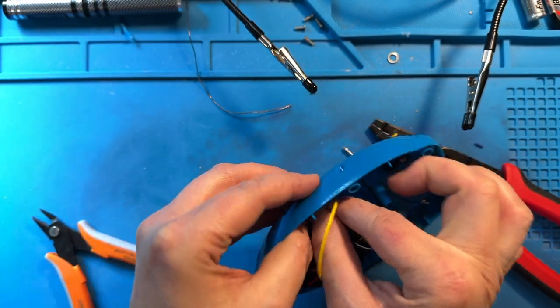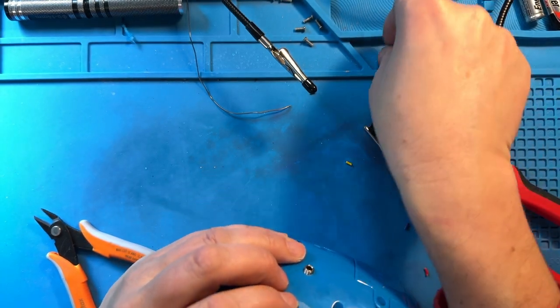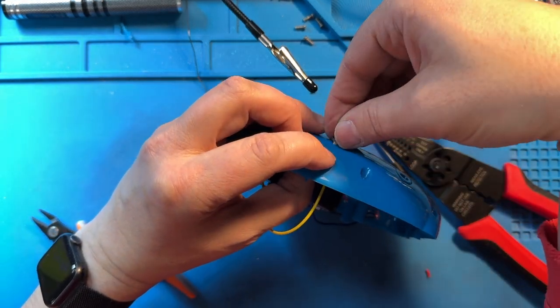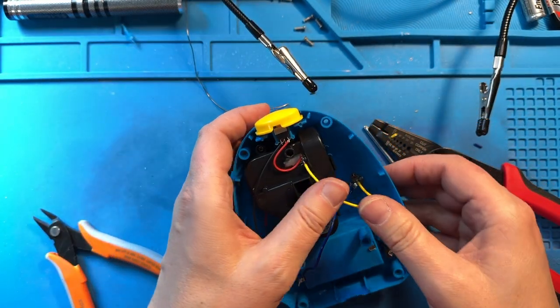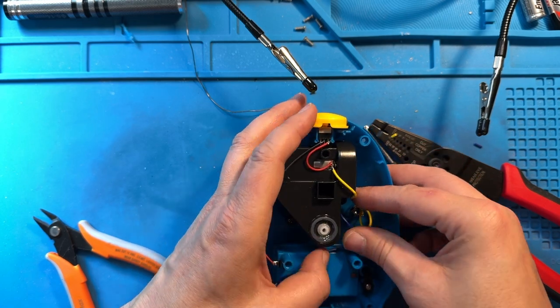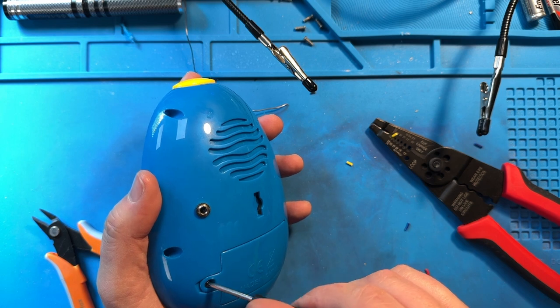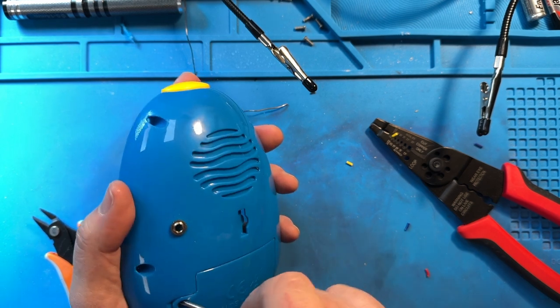Now we're going to push this through our hole and grab that nut to secure the audio jack to our housing. It helps if you've got small fingers. We're going to tighten that down. I like to always test before putting it all together so I don't have to take it all apart again. So next we're going to test it — we'll find that screwdriver, take off the battery compartment, drop our batteries in, and make sure it still works.